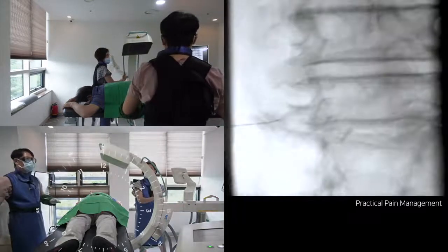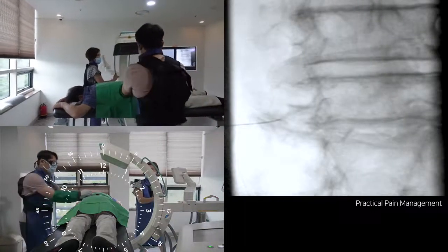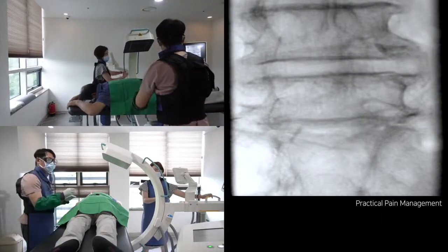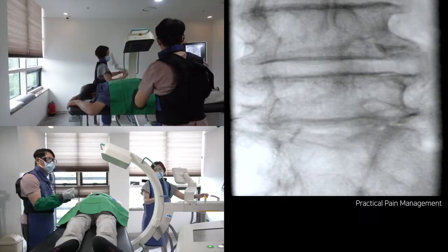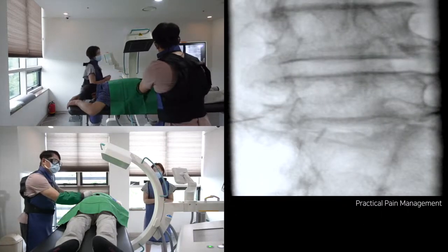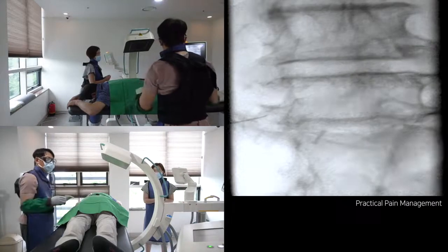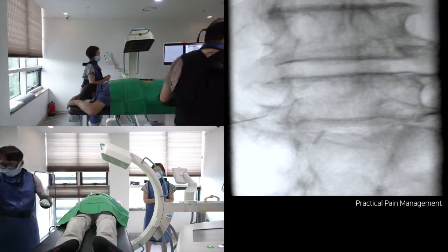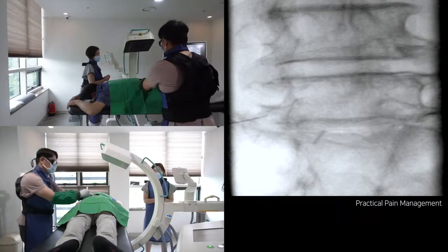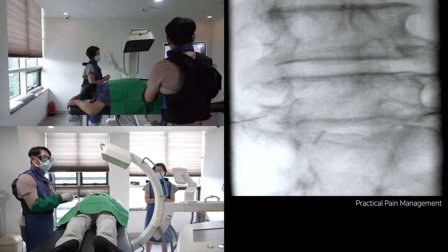Let me show you an AP view and a contralateral oblique view. The compass visualizes the contralateral 35 degrees. There is a long way to reach the final target point. I am supposed to advance the needle to the inferior 6 o'clock pedicle position. But, narrow disc space with protruded black disc displaces the nerve root upward and prevents further advancement.